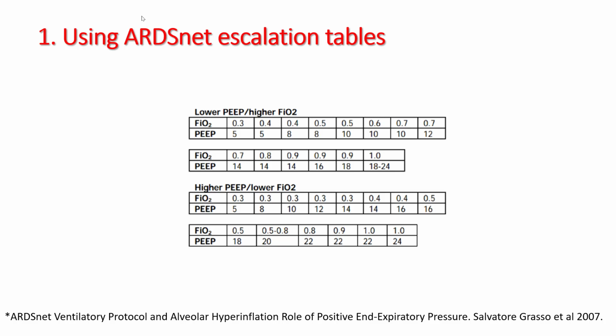These tables have been used for many years and they have not been shown to be inferior to any other method of figuring out PEEP in terms of mortality or length of ventilator days. So if you are not well versed in the ventilator, this would be a very reasonable way to initiate the PEEP before you transfer the patients.